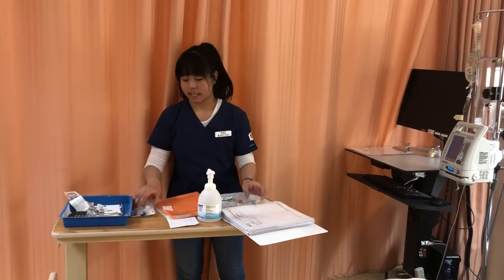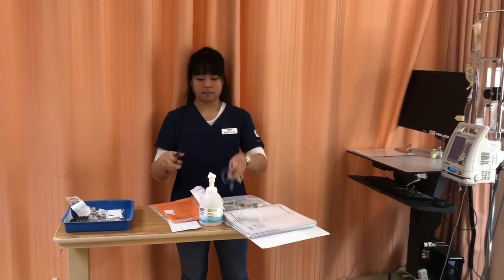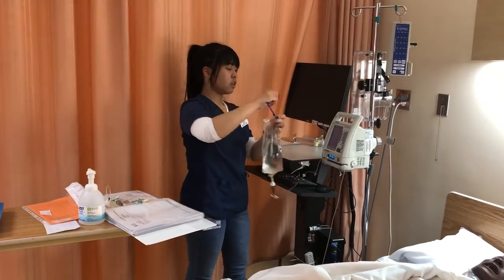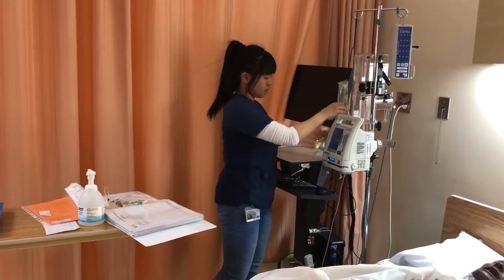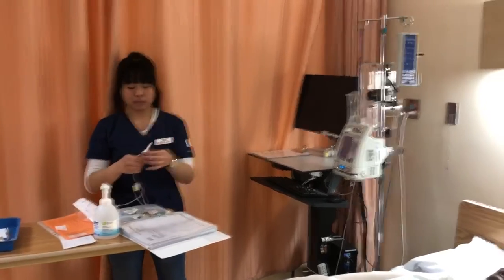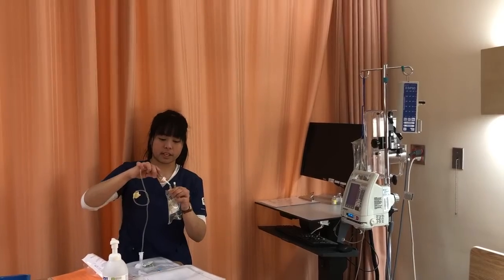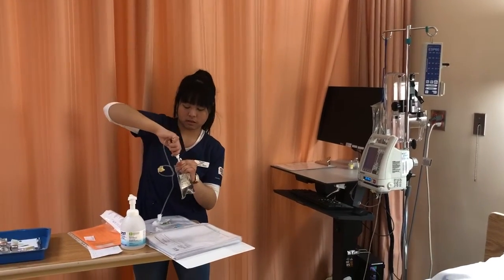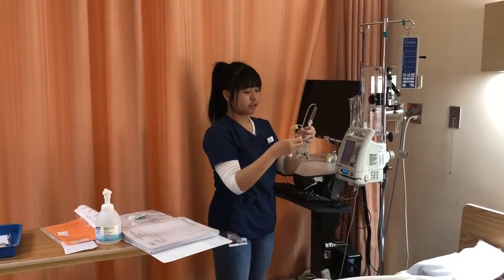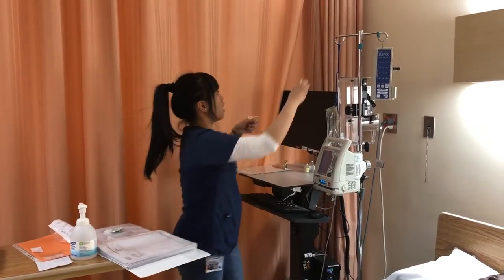And so now I will be setting up. I will first lower my primary infusion here. So, and then I will just clamp my tubing here, while maintaining sterility. Okay, so the cap is still on, so we're good. And I'm just gonna make sure that for now it is clamped so as to not waste any medication. We're good with that. Just gonna hang it here.